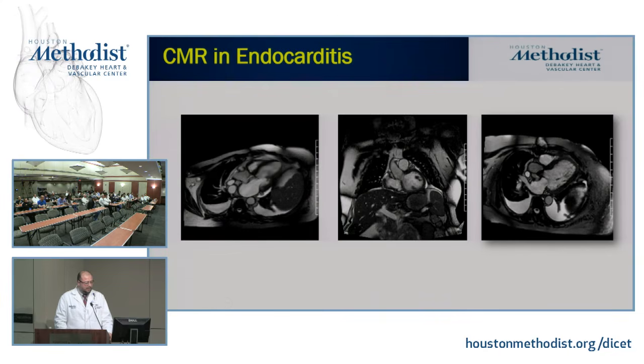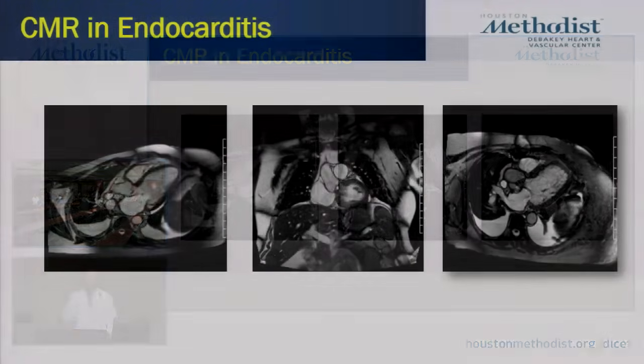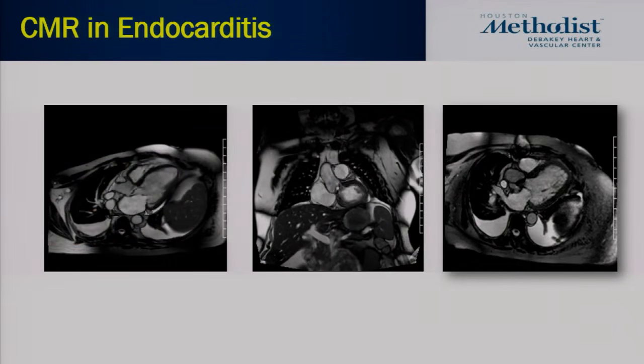So I'm going to quickly move on to MRI. One of the things about MRI is that I often see people send many cases where they see something highly mobile on echo and they want you to see it by MRI. That is very difficult, because remember, in MRI the image is acquired as a summed image over 8 heartbeats, or even 6 heartbeats if you're using fast imaging.